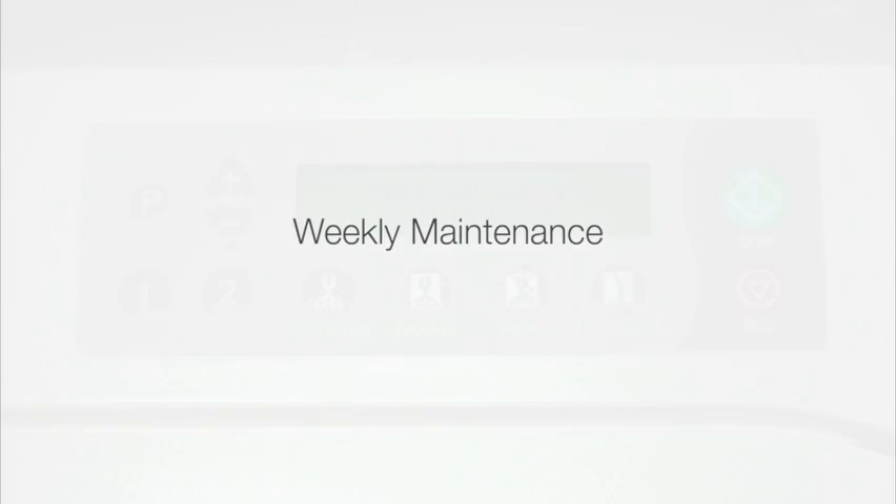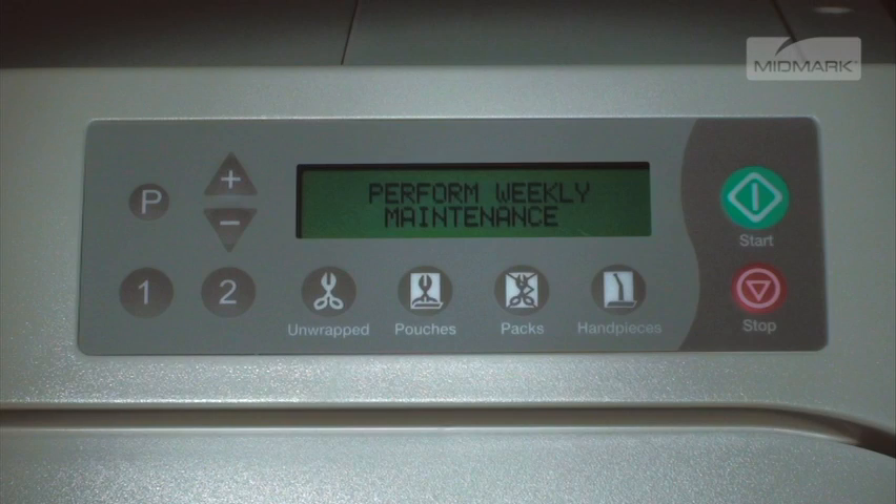Every seven days, the autoclave will automatically display the Perform Weekly Maintenance message. Weekly maintenance consists of two operations: changing the water in the unit and cleaning.